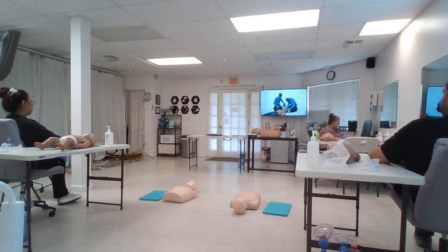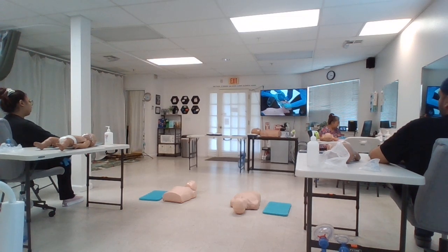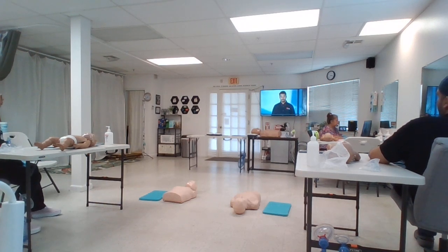The first rescuer will use both hands to seal the mask to the person's face and lift the jaw. The thumbs and index fingers of both hands each form a C to seal the mask against the face, and the three remaining fingers of each hand will form an E for lifting both sides of the jaw into the mask. Be careful not to press too hard on the mask, which could push the jaw down and block the airway. Now it's time to practice the one rescuer bag mask technique, so that in a few minutes, we can combine it with compressions to work on a two rescuer sequence.